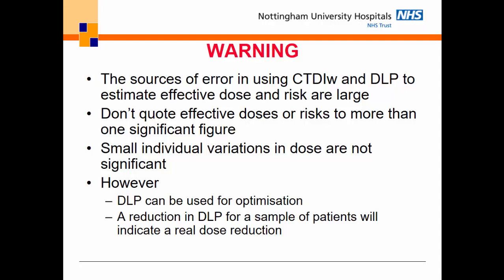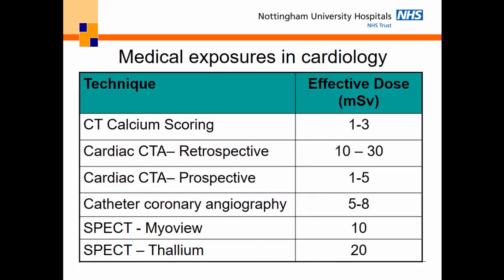Compare yourself with a sample. Get a sample of your data and a sample of their data, and if yours is lower, your doses will be lower than theirs. Okay. This is just really for your notes, just to give you some typical doses from the different techniques. They vary depending on where you are in the world, what your centre's using, but find out what the figures are for your centre. But it just gives you a sense of, in millisieverts, roughly where we're talking. Okay?